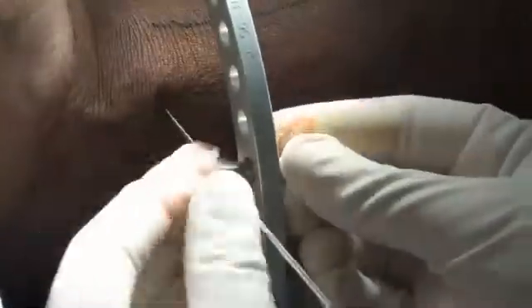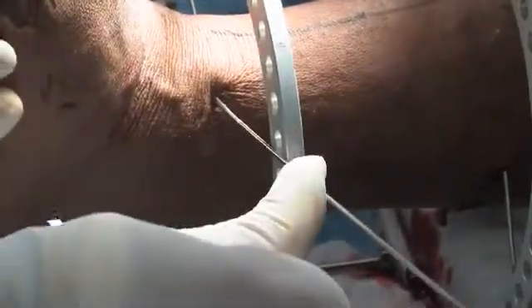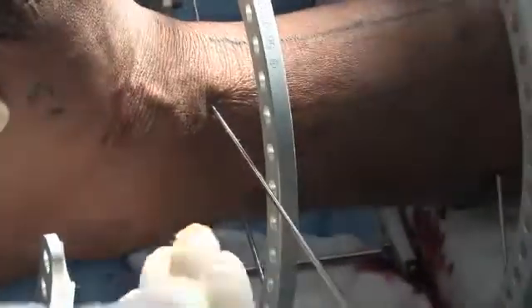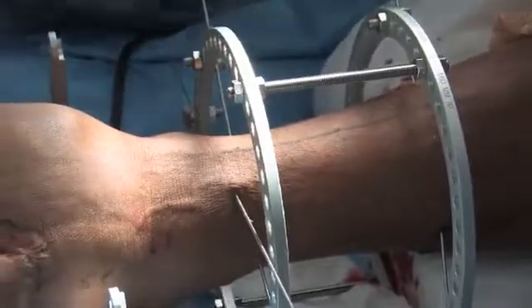Let's put a washer in there. So this is a key point here where we've got a space between the wire and the frame. If we bend the wire, that puts tension on the bone. So what we'll do is we'll put 2 washers on a wire fixation bolt and actually build it up to the frame. So I need 2 washers and a wire fixation bolt.